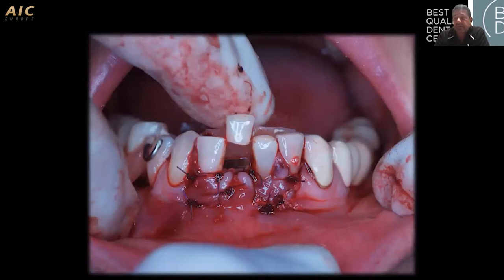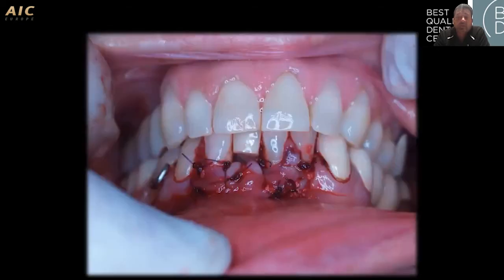And after that, because it's an anterior tooth missing, we need to put a prosthesis there. But we have to be careful that the prosthesis does not come into contact with the soft tissue and the region of the bone graft, to keep it as stable as possible. So we cut the tooth in the middle, basically, to avoid compression against the bone graft area.